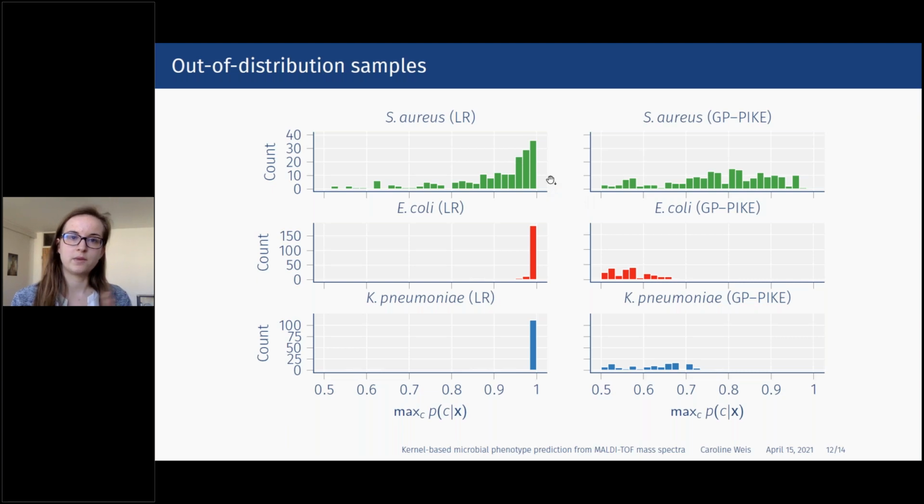which you can explain with the linear decision boundary of the classifier. If you have your training distribution, the classifier will learn a separating plane to separate resistant from susceptible samples. But if you give it a sample that lies very far away, because it is out of the training distribution, it lies far away from the decision boundary. Therefore, the classifier will give it a high confidence estimate because it thinks this is a sure thing. It's very confident about that. So this is actually not the behavior that we want. We would give falsely confident estimates.